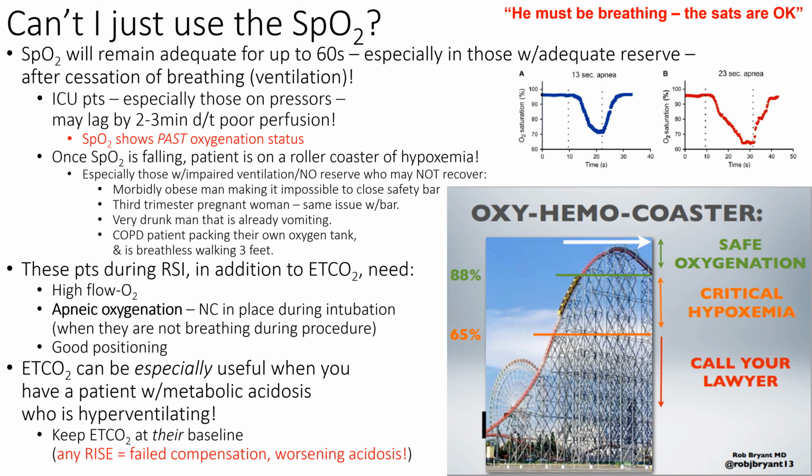All right, so why measure end-tidal CO2 for someone? Why can't I just use the pulse ox? Well, that would tell me how they're ventilating. It absolutely won't, right? So it can tell you that if you ventilate and you get oxygen in, you should get a rise in your pulse ox, right? Your pulse ox should sustain. But what if there's differences, there's delays.